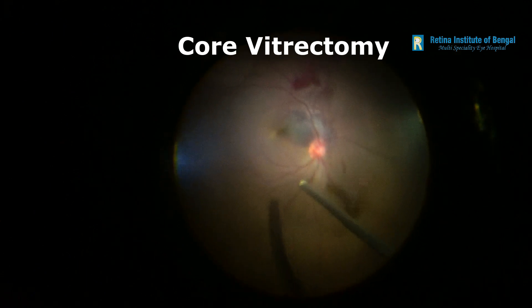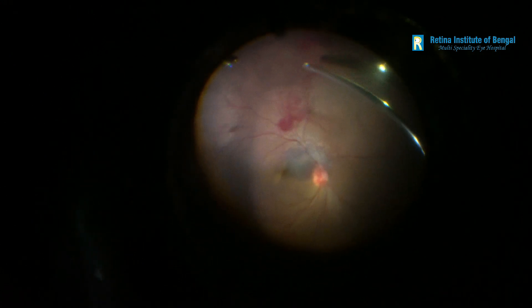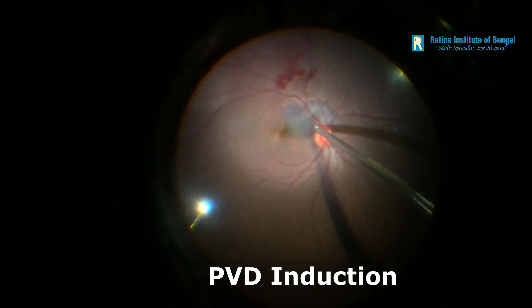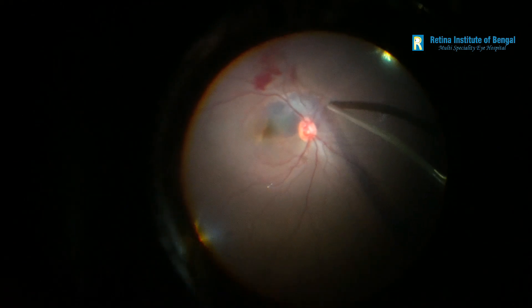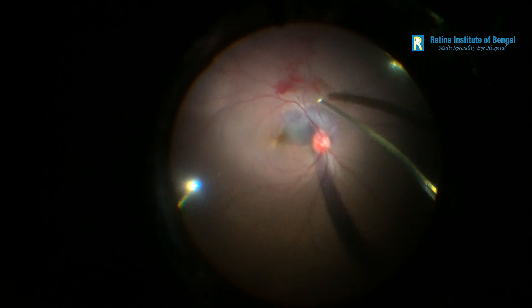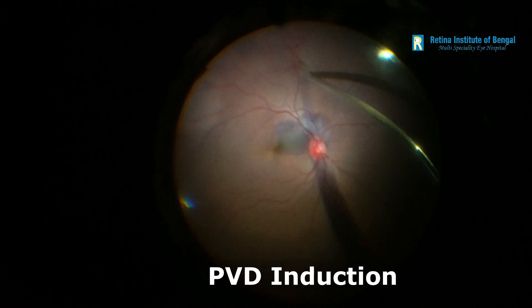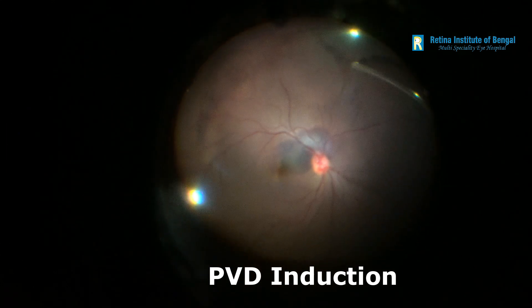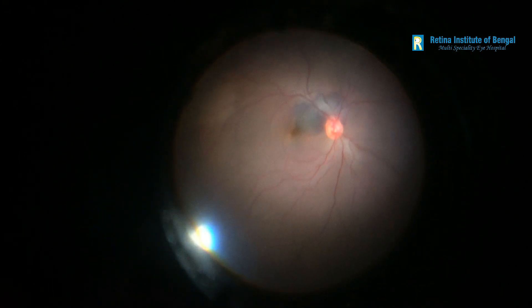We began the surgery by doing a central vitrectomy to remove the blood in the vitreous cavity. Once all the blood in the vitreous cavity along with the central vitreous had been removed, the next step was to induce a posterior hyaloid separation. This is always done very carefully to ensure that we don't end up damaging the retina. The cutter is kept in suction only mode, and thanks to the OS 4's great holding ability, this is done very easily with this machine.